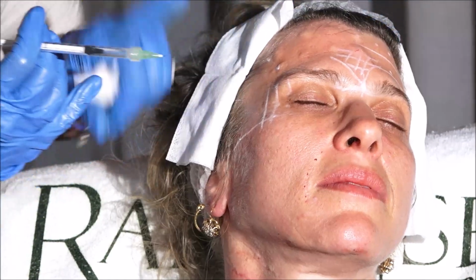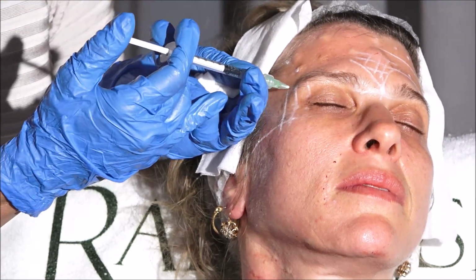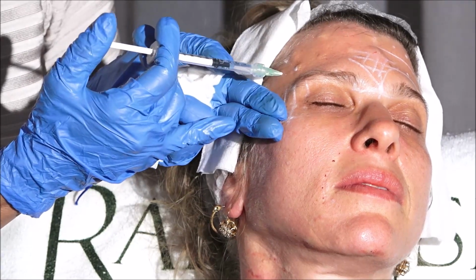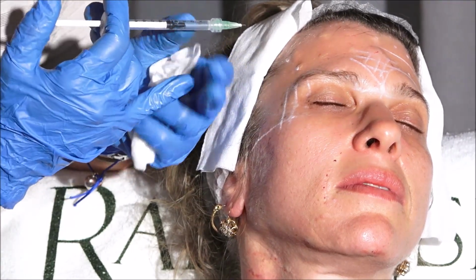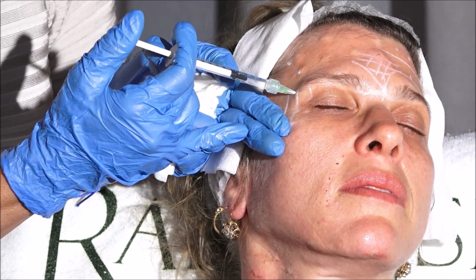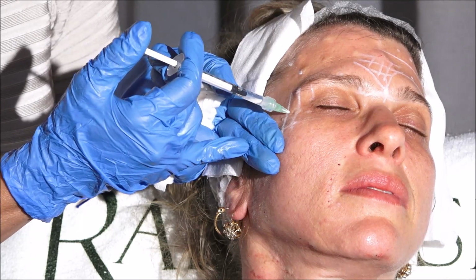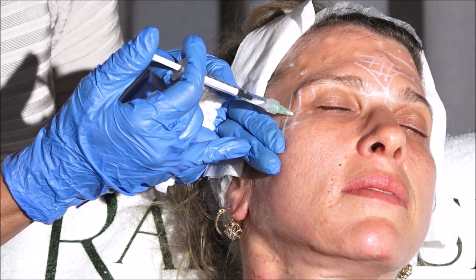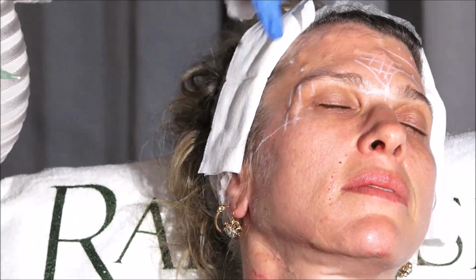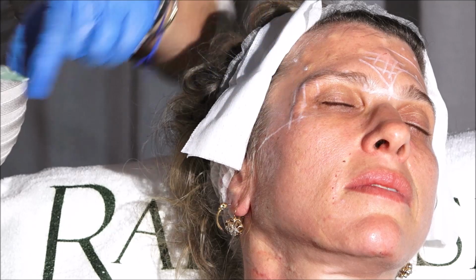Let's go for the orbicularis. So we said 3, 6, 6. Here I hold 1/3 of my needle in, or half of my needle in, because I need 2 millimeter at least. So half, 3 units. 6 units. I want, again, for you to see the roundness like this.